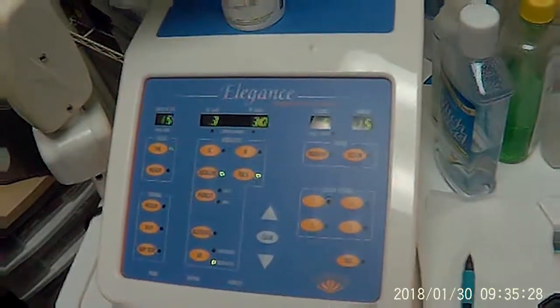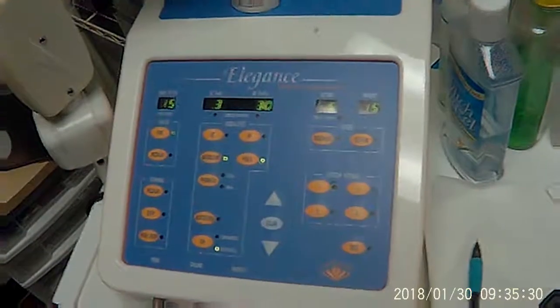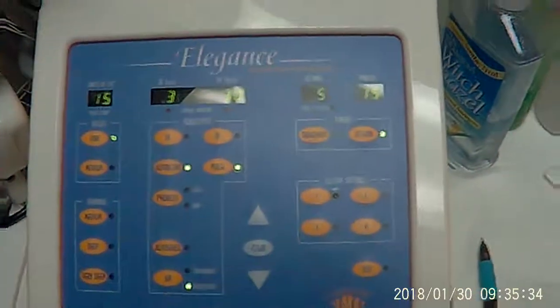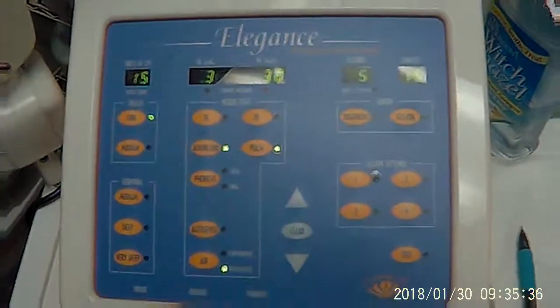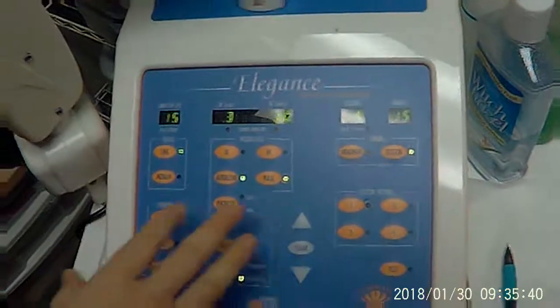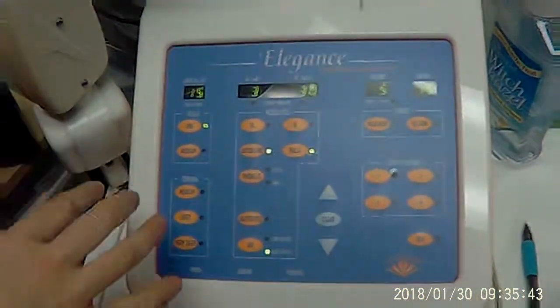Okay, Liz. Allison is going to show you how to work the Claire Blend machine. I'm just going to try to film the face of it where you can see the buttons and let her talk. Hey, Liz. Here we're working with the Claire Blend Elegance machine.